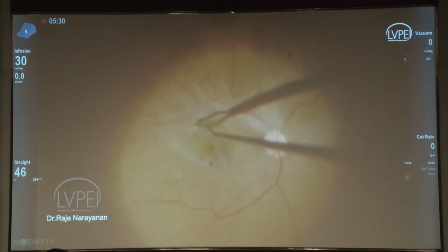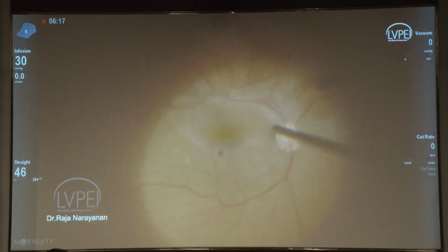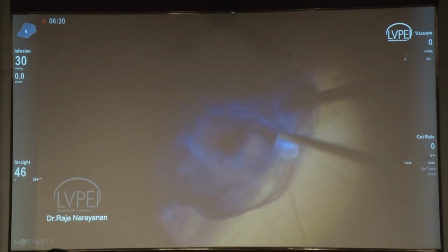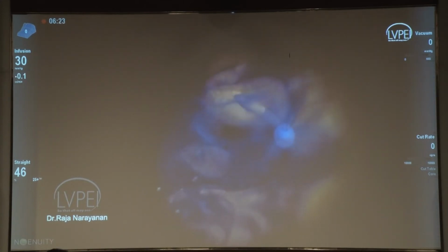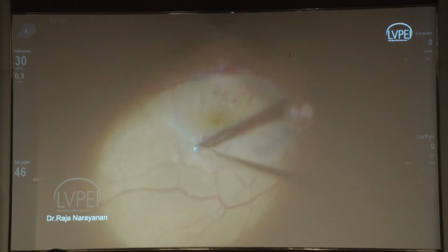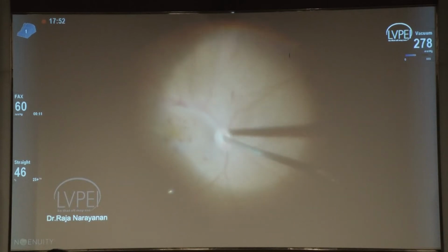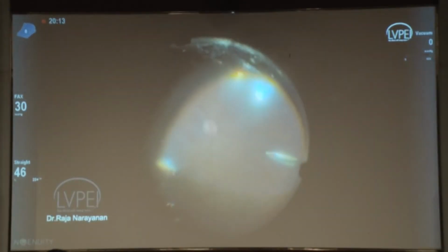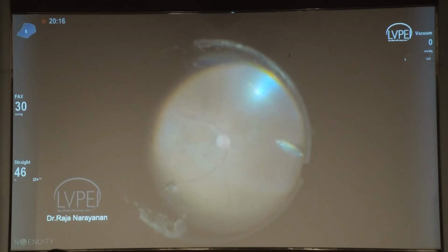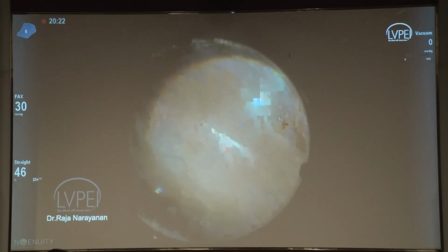Although in that particular study where we published, we did not remove the ILM specifically in those cases. So again, after the ERM removal, we stain the ILM with brilliant blue, peel the ILM in a standard fashion. Because these are epiretinal membranes, you don't have to do an inverted flap or any of those modifications. You just do a standard ILM peeling, and I do a fluid air exchange before injecting the intravitreal Ozurdex implant. So I remove one of the cannulas, and then at the end we inject it, and you can see it nicely resting over the optic disc.